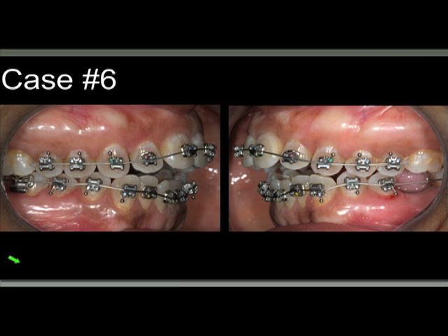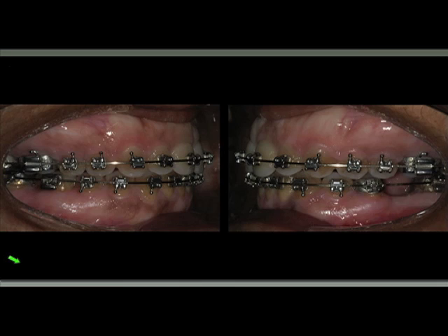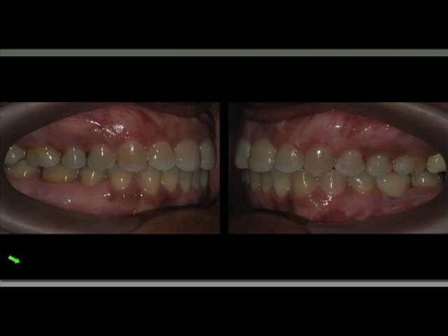This is an open bite where we have to leave a space in the left side for the implant. And basically this is the first wire. This is just before the appliances were removed. And you can see the next photograph is the case finished with the implant in place and the crown.